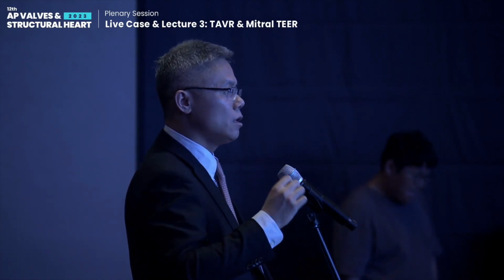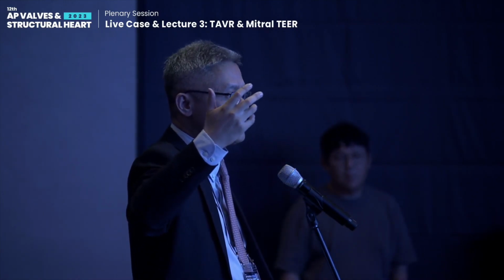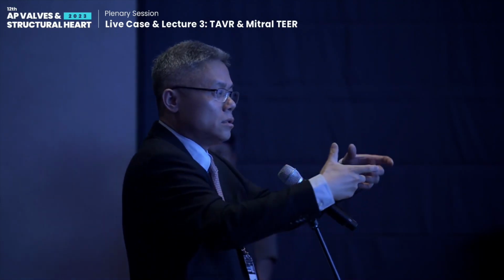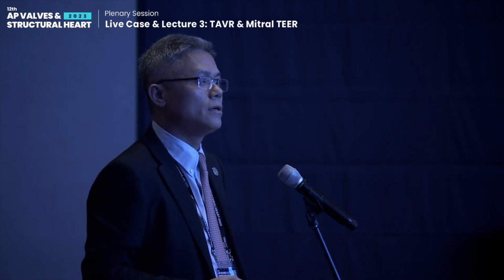It's suitable. If too high, maybe increased risk of pacemaker implantation. In the early stage, you can see the pacemaker implantation was quite high, nearly 30%. Recently, as you can see even in the live demonstration, the oversize ratio is only about 1.1. In all the cases, the pacemaker implantation rate decreased to 10%. Great. My understanding is oversizing index 1.1 means 10% perimeter oversizing, right? That's right, yeah. Wow. So I think the result is very excellent.